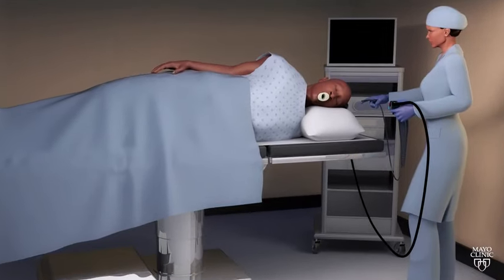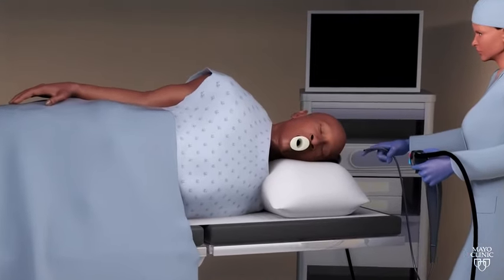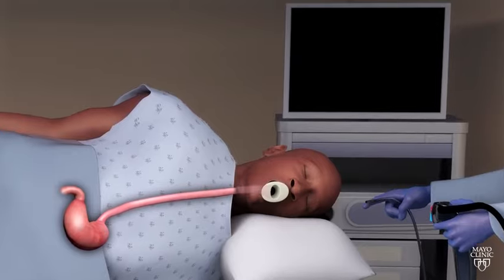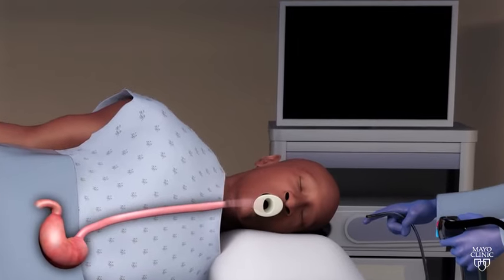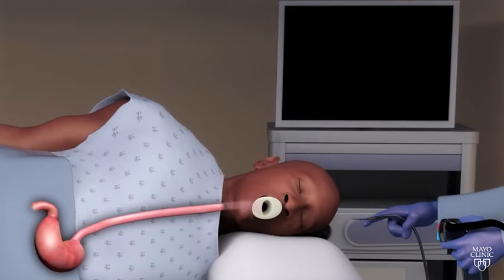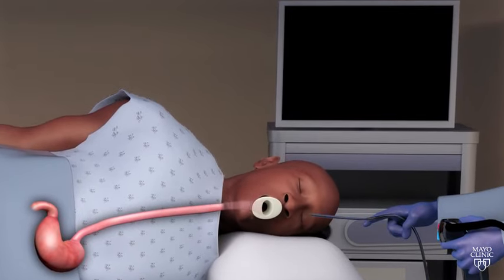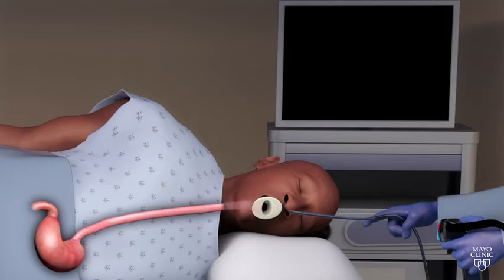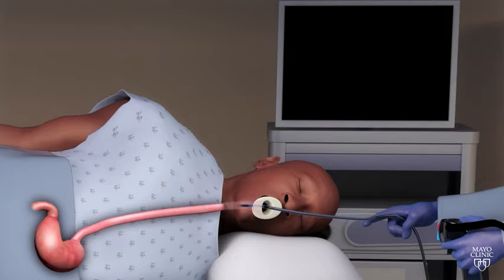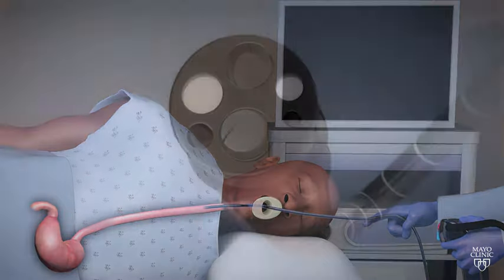An endoscopy is a procedure used to visually examine your upper digestive system. During an endoscopy, your doctor gently inserts a long, flexible tube, or endoscope, into your mouth, down your throat, and into your esophagus.